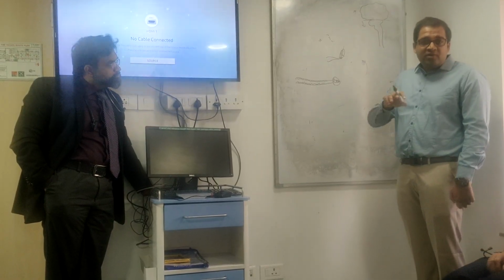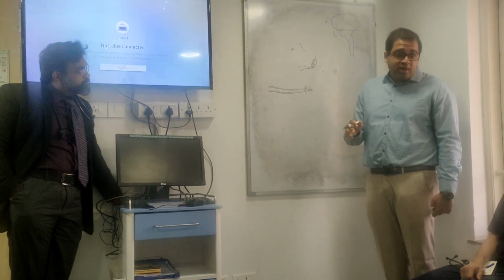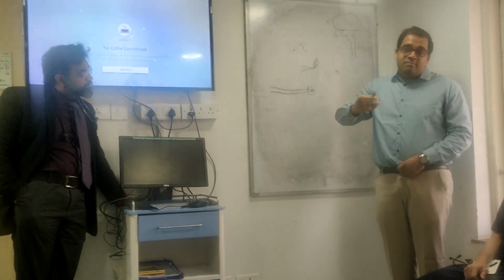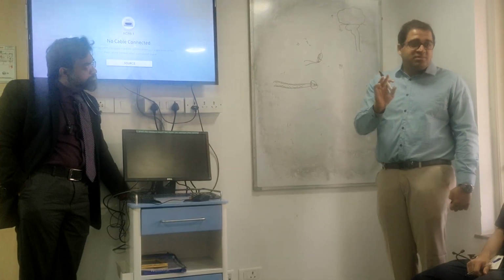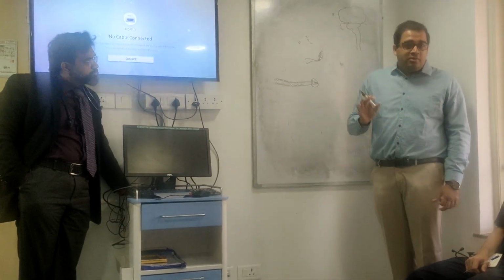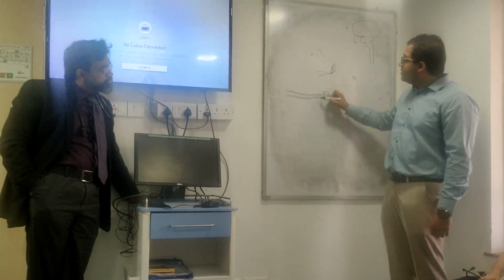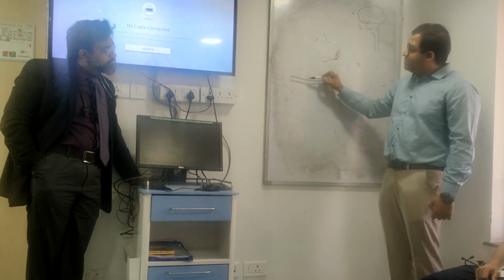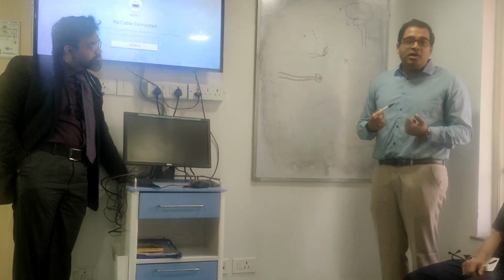However, I will put a caveat: if your cultures are not positive anyhow and you're still suspecting the line, you may still send it. I'm putting it as a may, and I do send it sometimes, but routinely we don't, because biofilm happens elsewhere and the sample is something else. If in the future we have a mechanism where we can take the biofilm off for culture, that would be perfect, because that is the proof of the pudding.